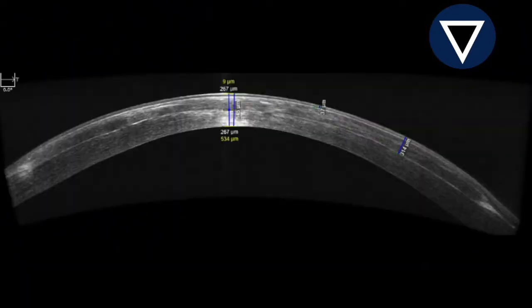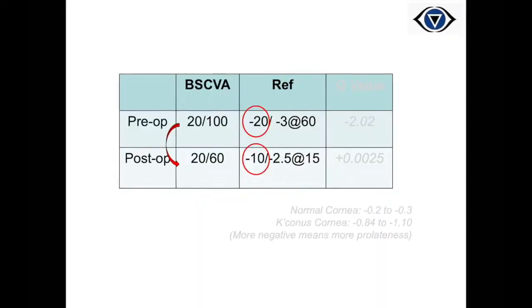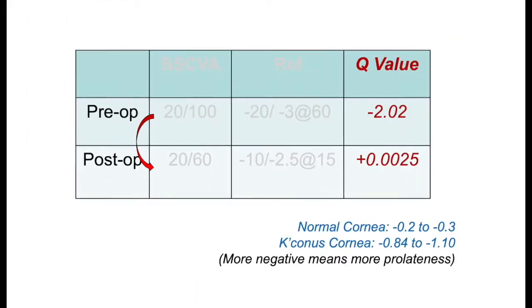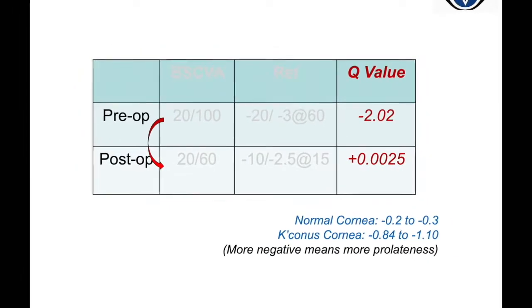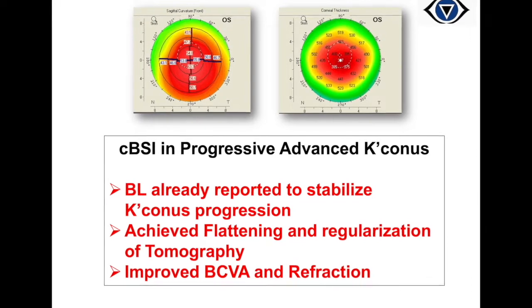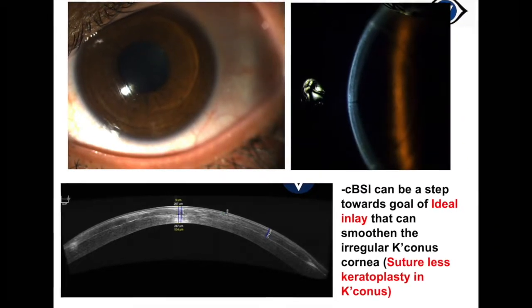The cornea is clear and compact, as can be appreciated on the anterior segment OCT as well. The keratometry decreased from 56.9 to 51 diopters, and improvement in refraction was also seen. Q value also improved after the surgery. Hence, CBSI helps in progressive advanced keratoconus by providing stabilization to ectatic corneas.